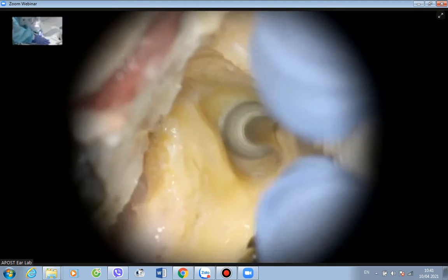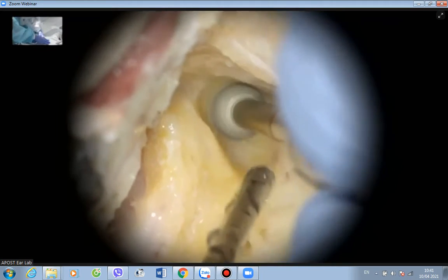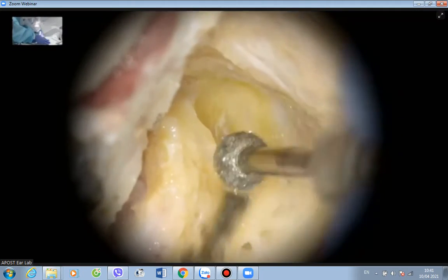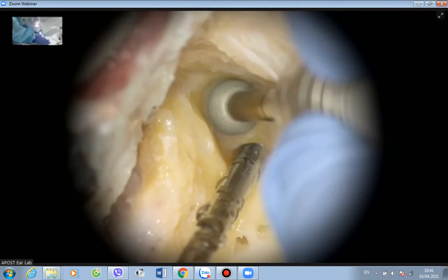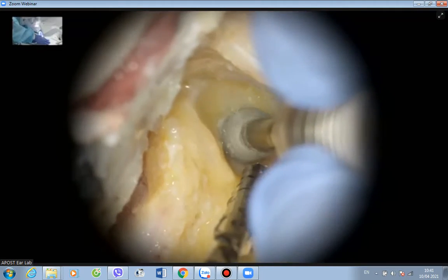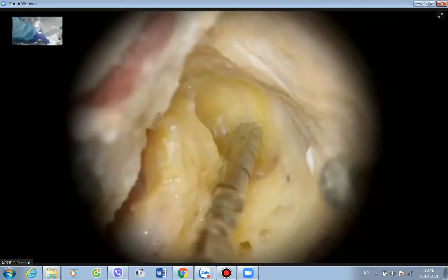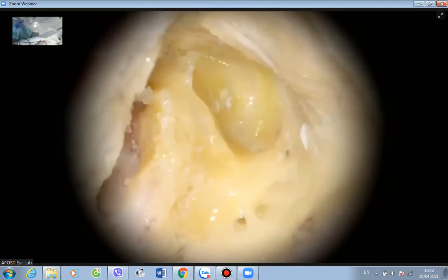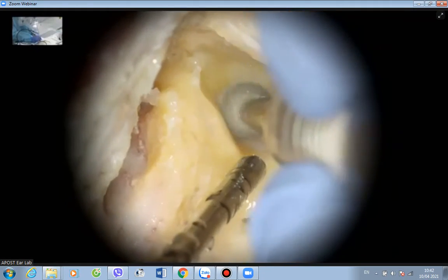Right, we're almost seeing it. See, you see the blue line? Yeah, you see the blue line of the superior canal. So try to practice this during your lab dissection in your own country, and you will appreciate how beautifully they connected with each other.